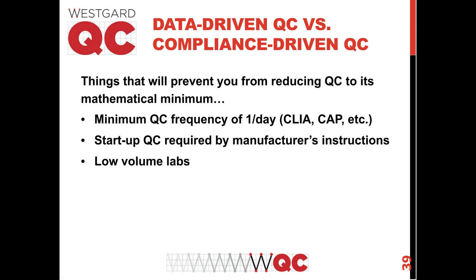Low volume labs, if you have a test where you're only running 100, 150 tests a day, but it's a 6 sigma method, well, you can't space out and say, well, now I only have to run once a week, because your volume shorts out, and then your clock starts again in 24 hours.